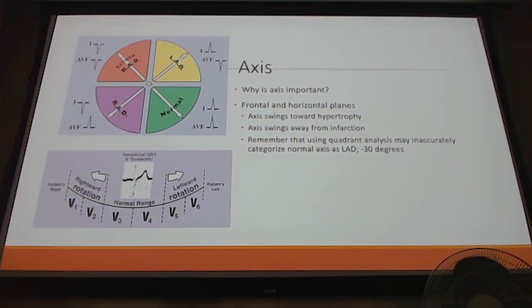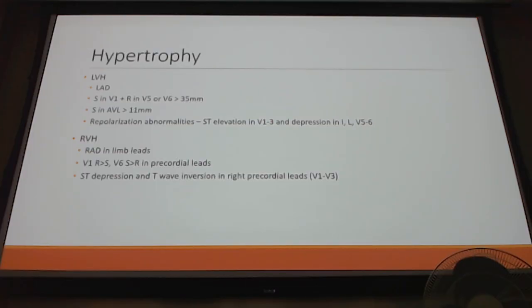And we can match it to this when we're looking at the EKG to say, okay, that makes sense with what pathology I have, whether it's affecting the left anterior descending artery, and I have the ST elevation and right axis deviation. So these are all just little cues to help us. I don't expect you to be experts on EKGs, but I do expect you to know ST elevation, depression, and which leads are associated with certain arteries or infarctions.